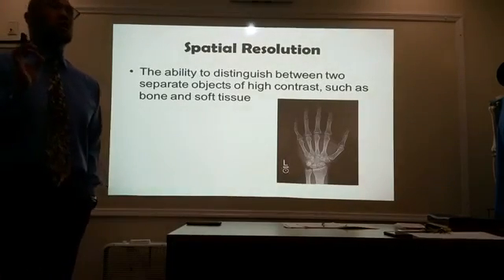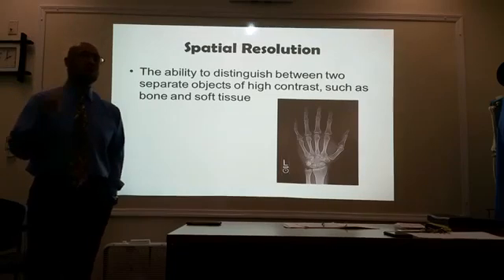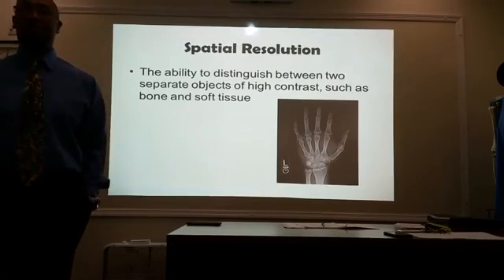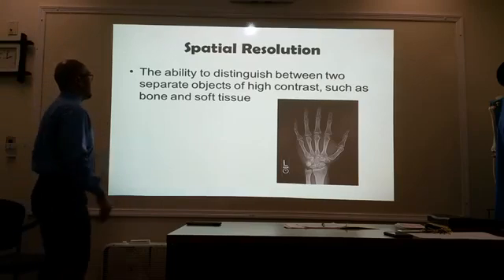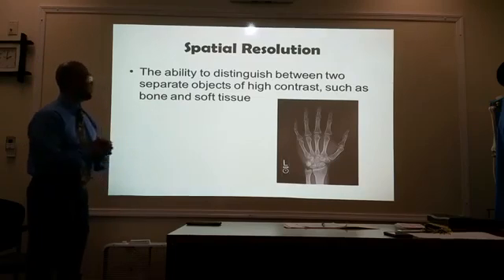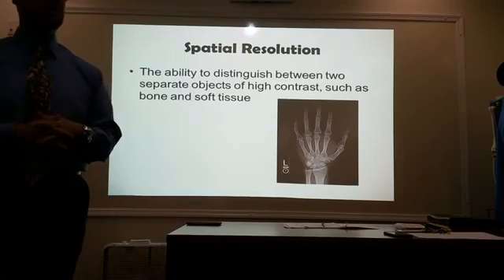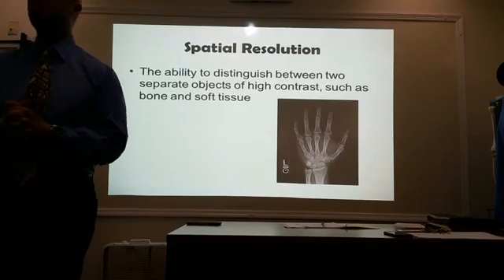This is the ability to delineate or differentiate objects that are not very similar, such as bone and soft tissue, two separate objects of high contrast.